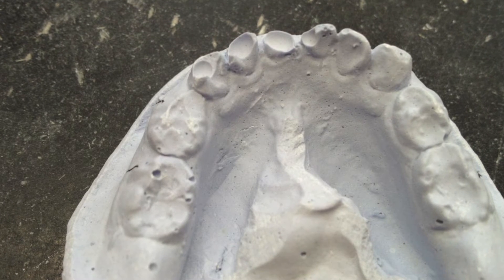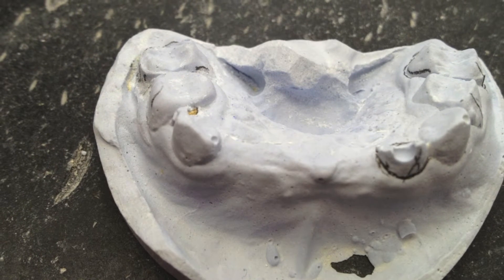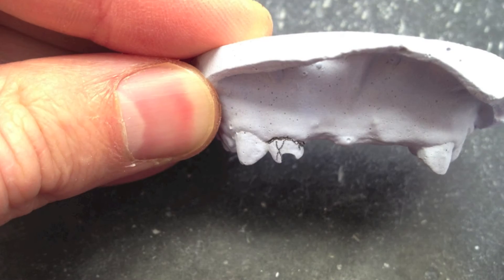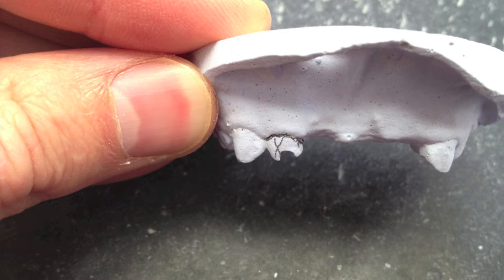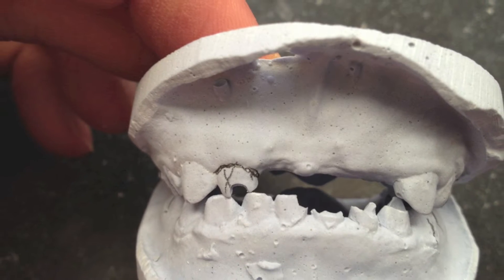Here are the models that I got to work from — they weren't poured up very good. They're good impressions, just weren't poured up very good. I was asked to remove that upper left, upper right incisor and replace all four front teeth.